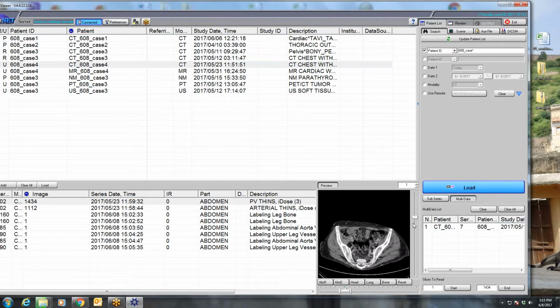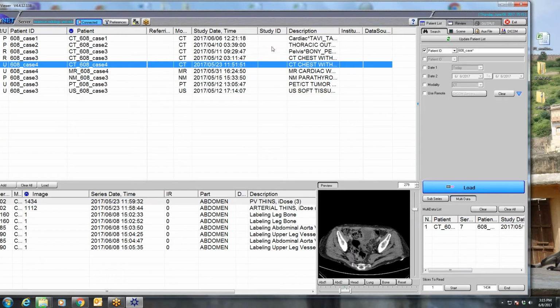Can I ask you a question about your previous case of angiosarcoma? When you say epicardium, do you mean the visceral pericardium, or the outer muscle of the heart itself, the myocardium? There's debate about where these arise. When I talk about epicardium, I'm more insinuating the epicardial fat, deep to the pericardium. Within that fat, within that area between the myocardium and the pericardium, that's what I refer to.